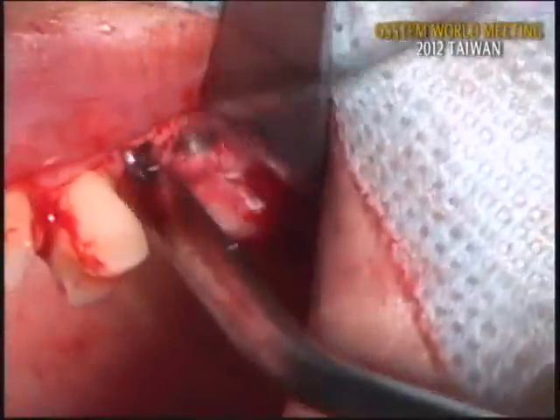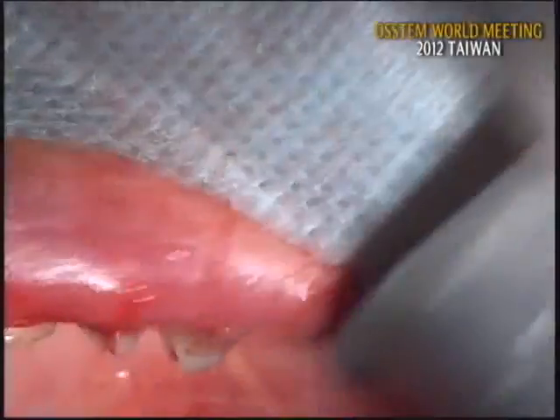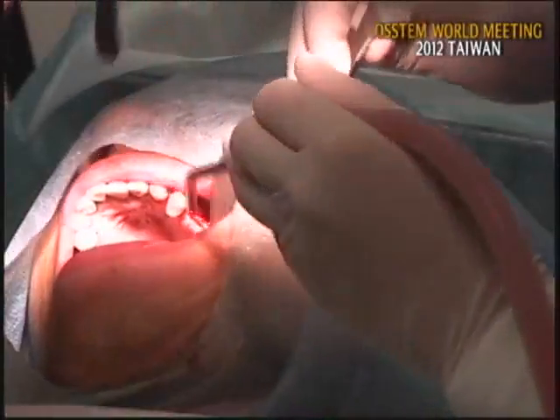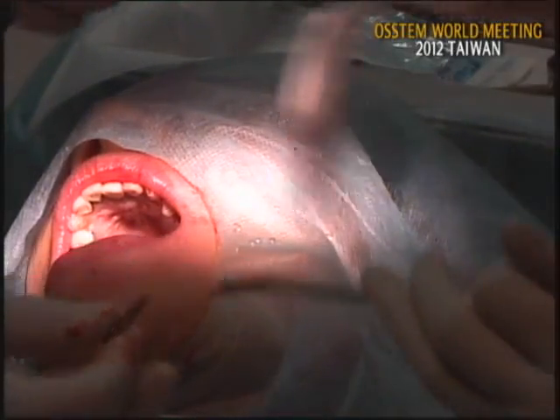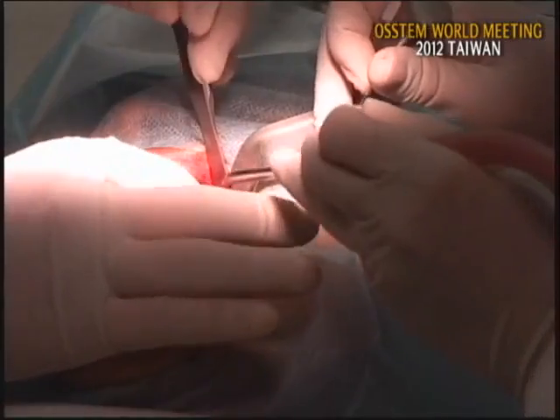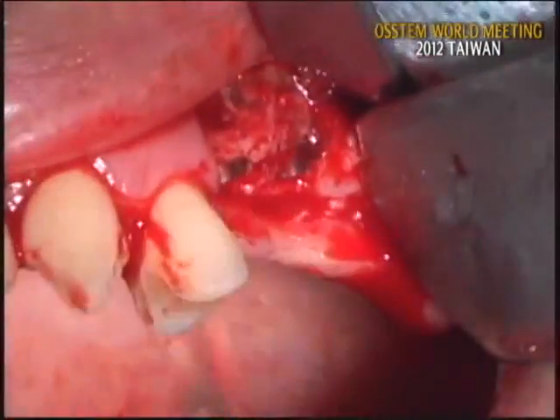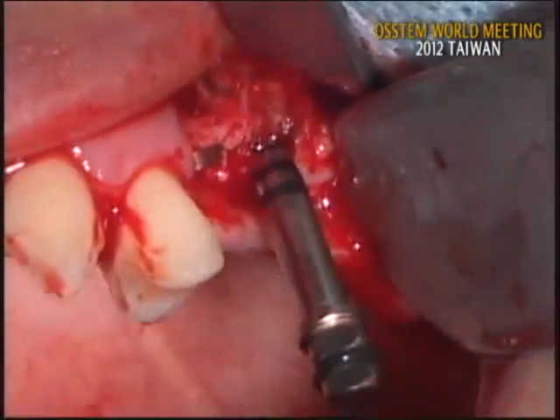Open, please. It's slightly buccal. Actually, usually I don't do this. I can finish the case connecting cover screw and close it. Then it's okay. But I want to show how to change the position of implant. I am not satisfied, this position is slightly buccal and slightly anterior. I will remove this one and let me show how to change the position of implant.